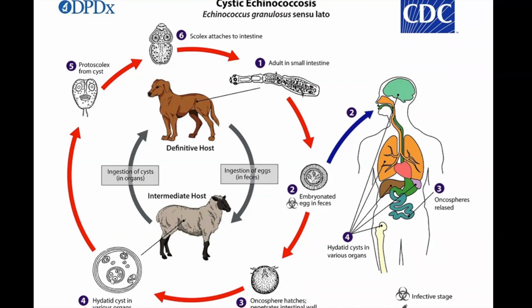And that's what we actually saw in the previous section, where you often see these daughter cysts, and they have this nice lamellated appearance to the material in the daughter cyst, and you have those protoscolices that we saw that have the hooklets in them. And so we don't actually form the complete worm in humans or the other intermediate hosts such as sheep.